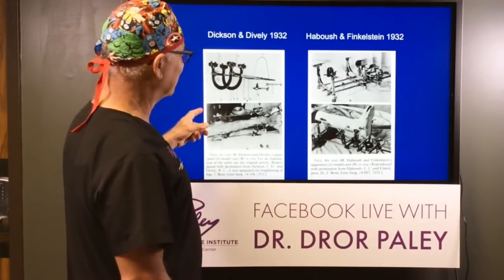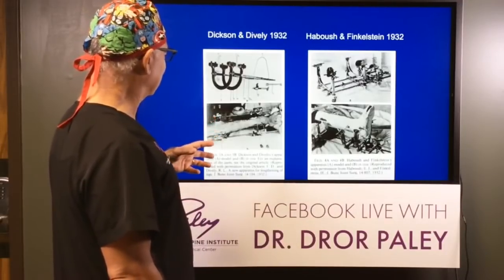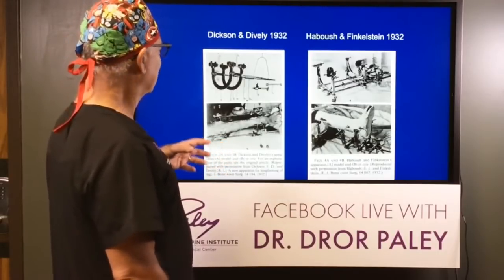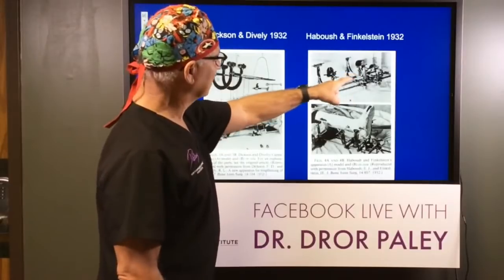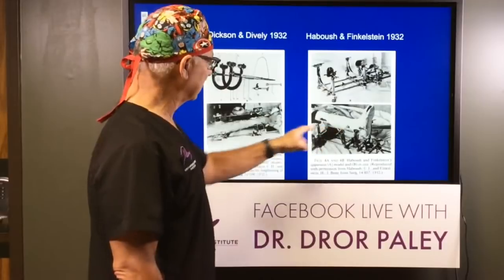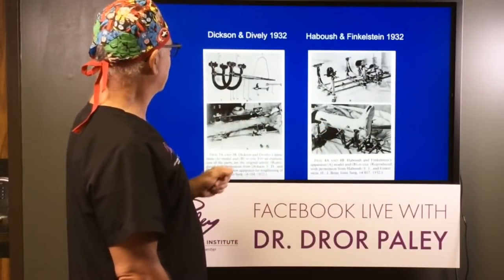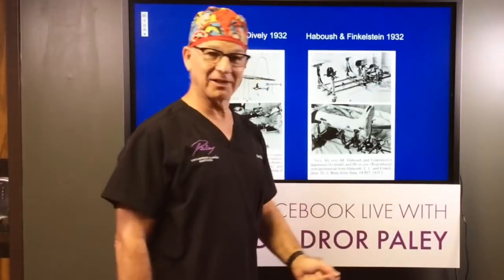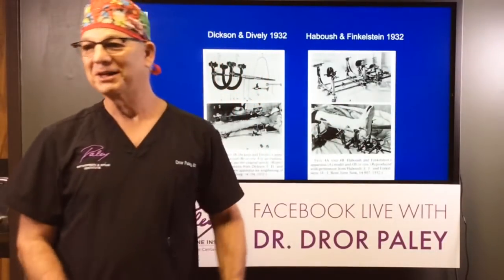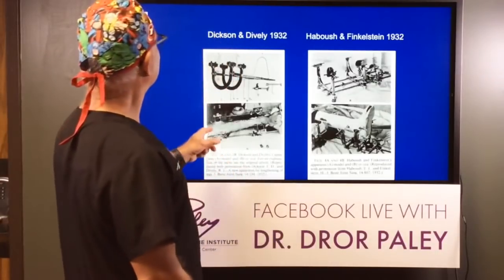So can you imagine, in order to get your leg lengthened, you'd come into the hospital, you'd never get out of bed for months. They'd put you in this device, your leg would lie in this cradle with pins going through, a cast on the leg as well to stabilize it. You see all the pins going across. And the nurse would come around. At the bottom there's a crank. And the nurse would come around each day and go, whoop! The patient would scream and she'd walk away. Okay? That was limb lengthening in 1932. Okay? So limb lengthening has come a long way.